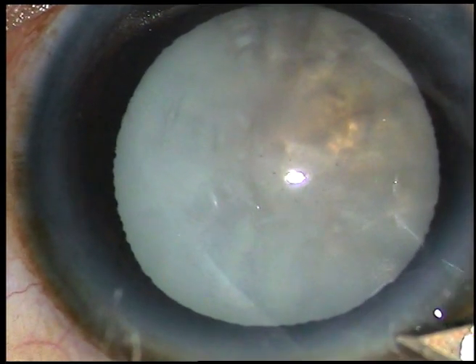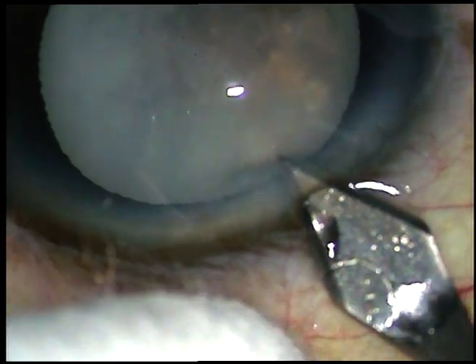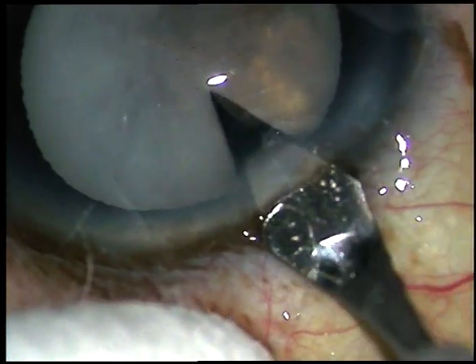Dear colleagues, this is a hypermature Morgagnian cataract. I have taken up this case for surgery. Let us watch the steps.